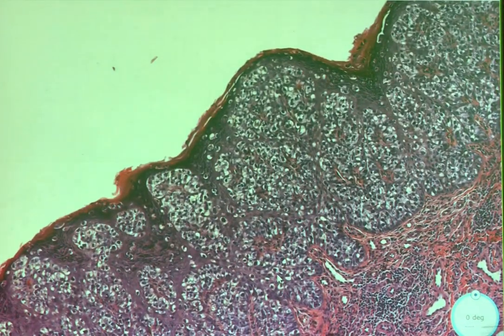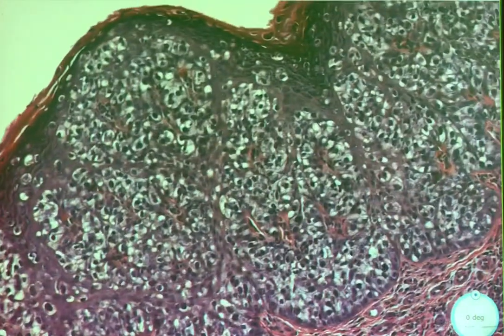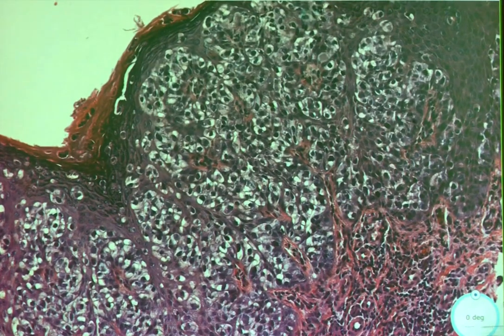So this is more like a Paget-ey moment. And the cells would be Paget cells. Funny you should say that. Yes. Yeah, because it's so clear and there's so many of them. My question to you, though, is when we say Paget's, we're usually referring to what area of the body?